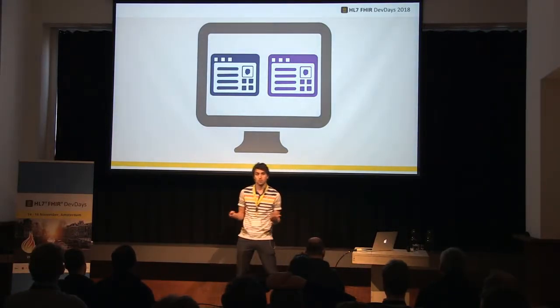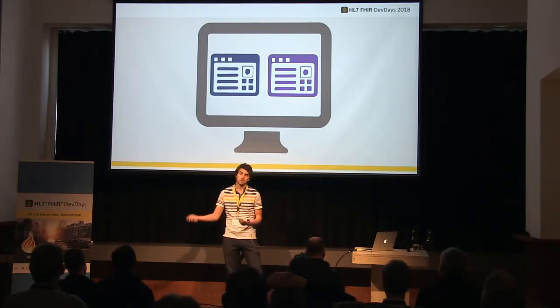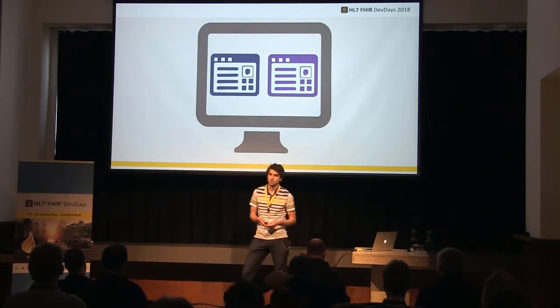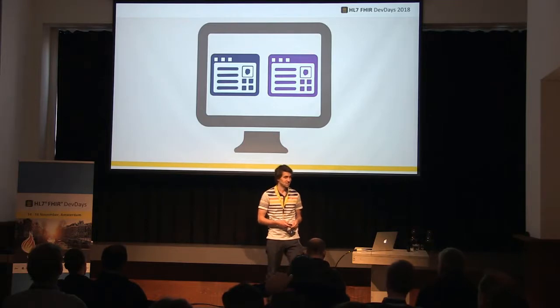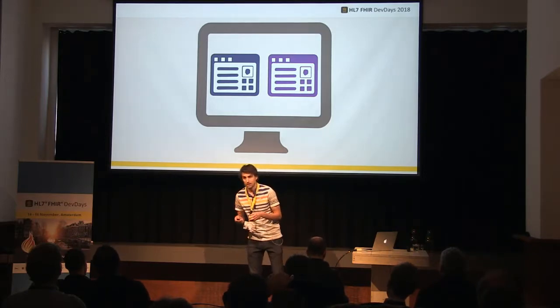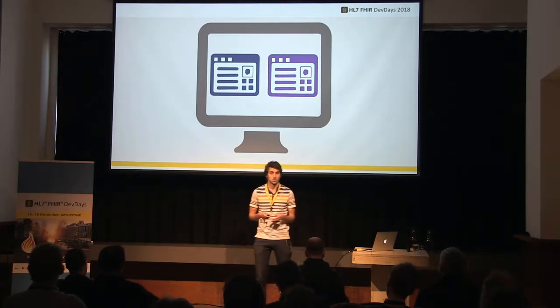You can't have the EHR showing one patient and the dictation system showing another patient and the PACS system showing images from a third patient. The reports will be random at best. So it's crucial, and our users will be very sad if this doesn't work. It's a really scary situation when it doesn't work, and it's super important that it does.